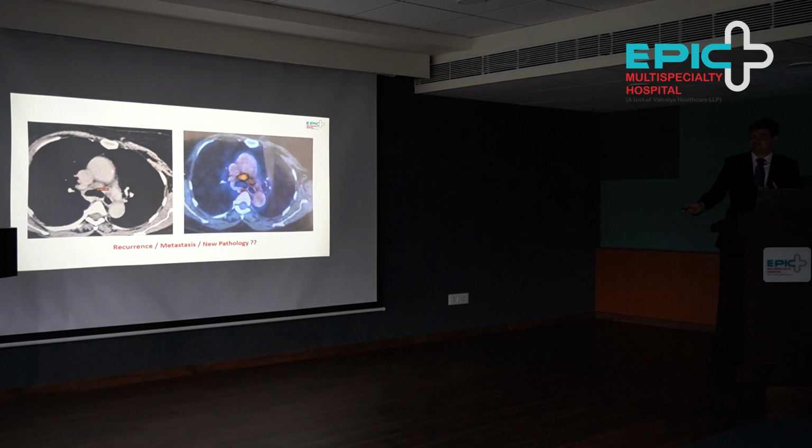This structure is the aorta. This is the ascending aorta, descending aorta, this is the pulmonary artery, this is the SVC, and where we are seeing the lymph node here, it is beautifully getting lit up in the PET scan, as you can see. So this is the middle mediastinum. There are great vessels, and the pathology is here.